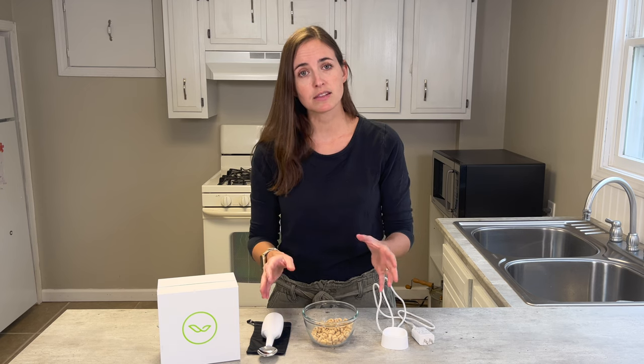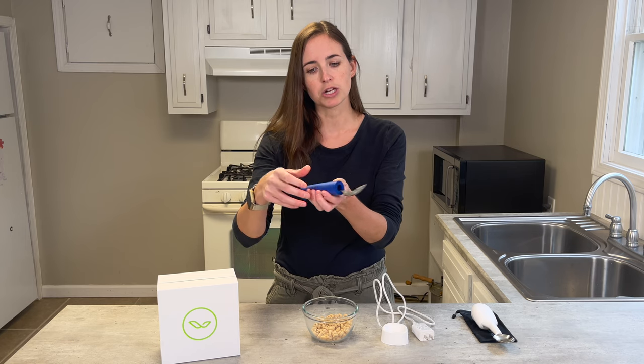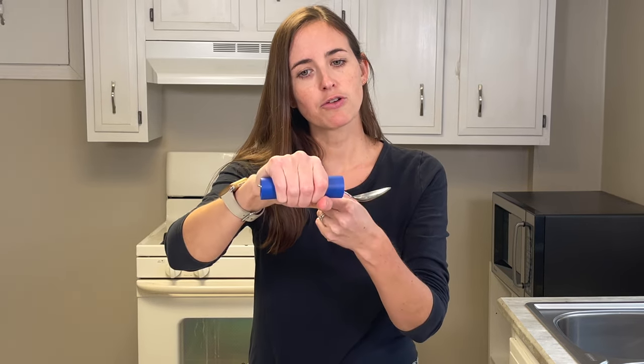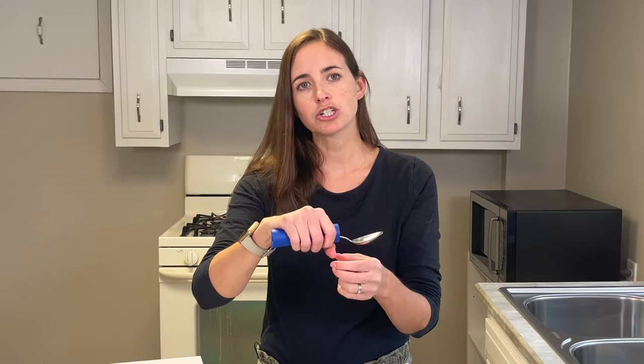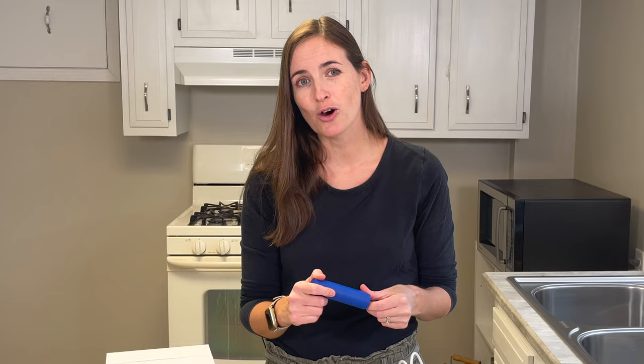Do not worry if this isn't the solution for you — there are other options. Some alternatives to gyroscopic silverware solutions include simply adding extra grip to your standard silverware. While this won't add shock absorption, I found that for my client with very large amplitude intentional tremors, having something squishy and soft to grip actually helped her apply greater pressure and reduce tremor amplitude. When combined with a wrist weight — a wrist cuff with one to two pounds, no more, to avoid fatigue — that combination can be really effective. There are many ways to deal with tremors while self-feeding.